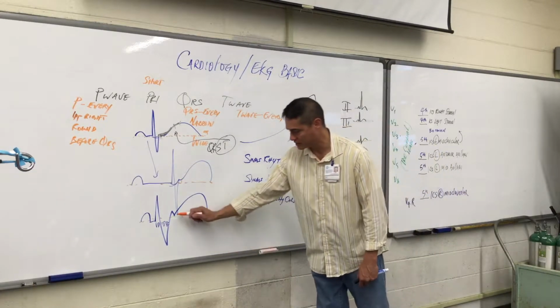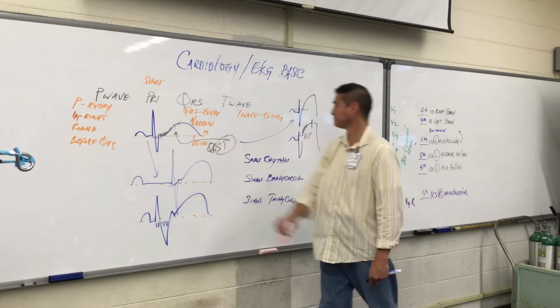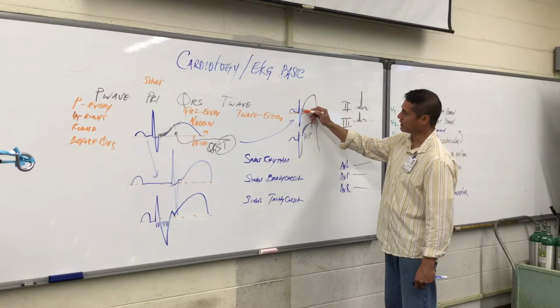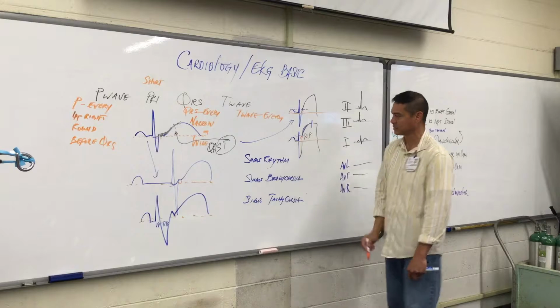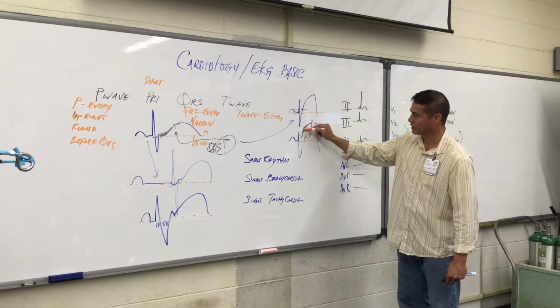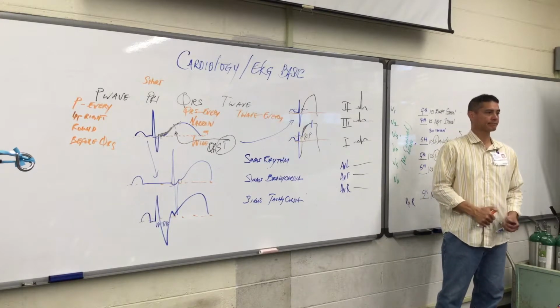It's not that big. This one is kind of downward. This one has none. And if you draw your baseline here, you'd say, oh, I got something here because that's elevated. And again, your baseline here, okay, I got some elevation there. In fact, this whole ST segment is quite elevated as it's starting to go up. It's sharing that elevation.